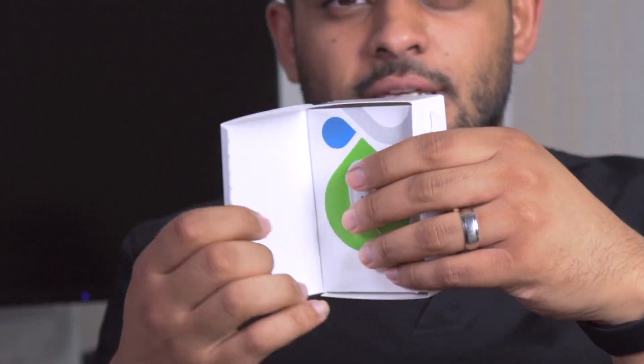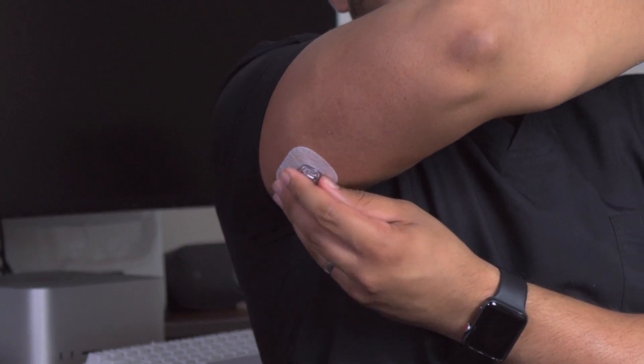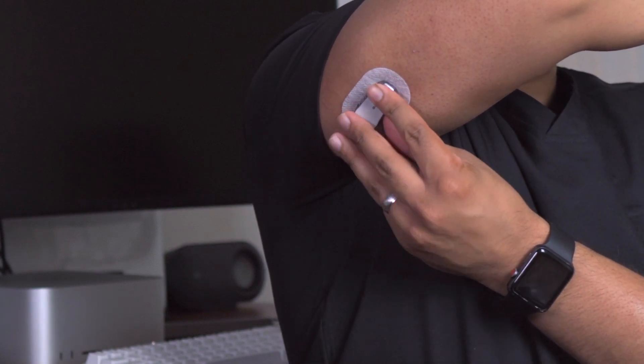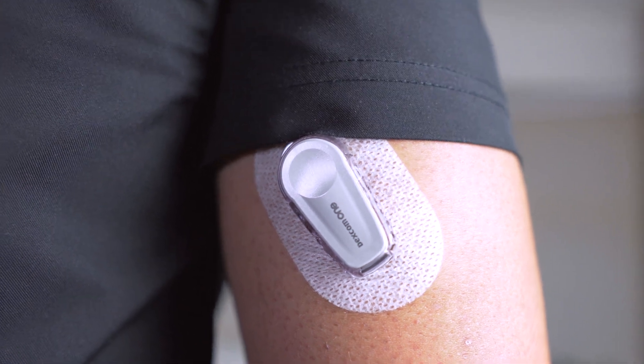This is my transmitter for the Dexcom One. Let's open this device here — you can see it just over there. I'm going to put the Dexcom One transmitter in. Feeling the way it goes, I can't see anything, but it should go in like this, and then I click it into position — relatively easy, even without looking at the device.